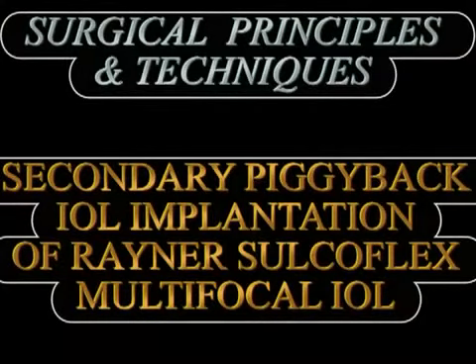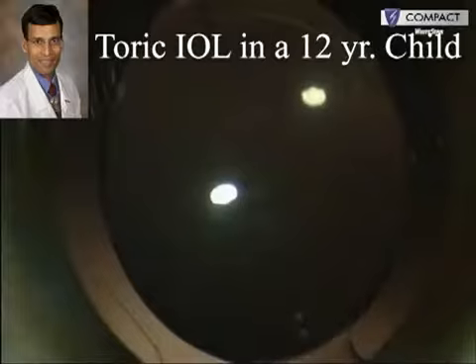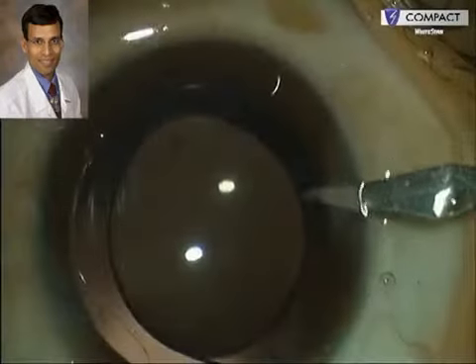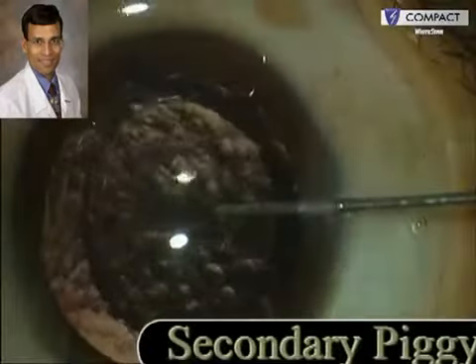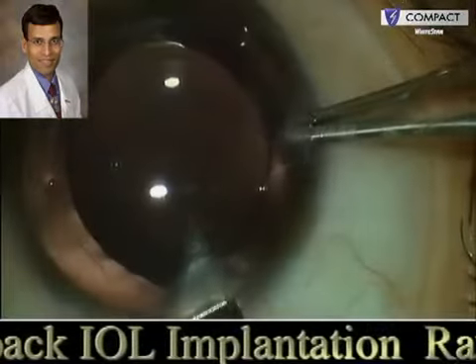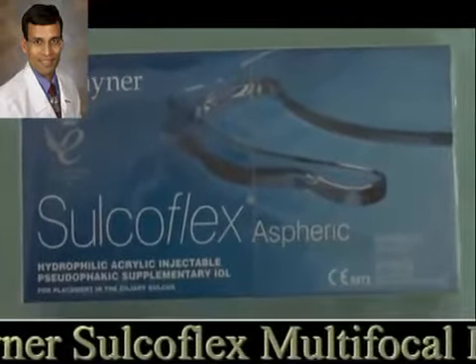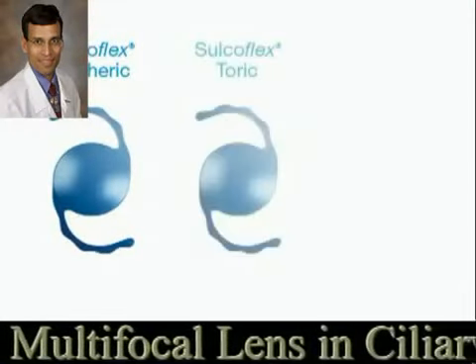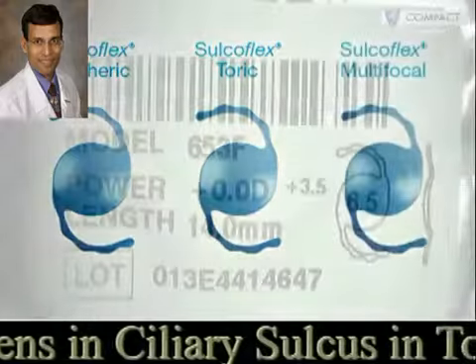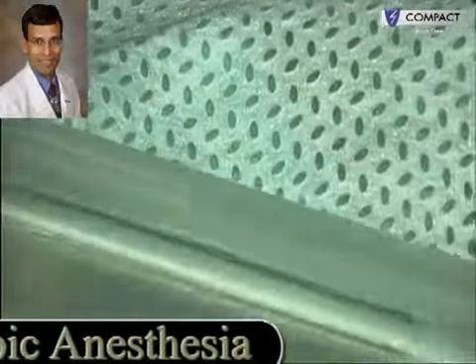Secondary piggyback IOL implantation is a very useful technique for managing cases of refractive surprises after cataract surgery. This is a case where a primary IOL implantation has already been done; the first IOL is very well centered within the capsular bag, which is a prerequisite for attempting any secondary piggyback IOL implantation. The corneal endothelium is coated with a dispersive viscoelastic device, and a Rayner Sulcoflex IOL is being used — a hydrophilic acrylic lens specifically designed for implantation into the ciliary sulcus in a piggyback manner for managing refractive surprises. In this case, we are implanting a plus 0 diopter multifocal lens in a young patient with a developmental cataract.